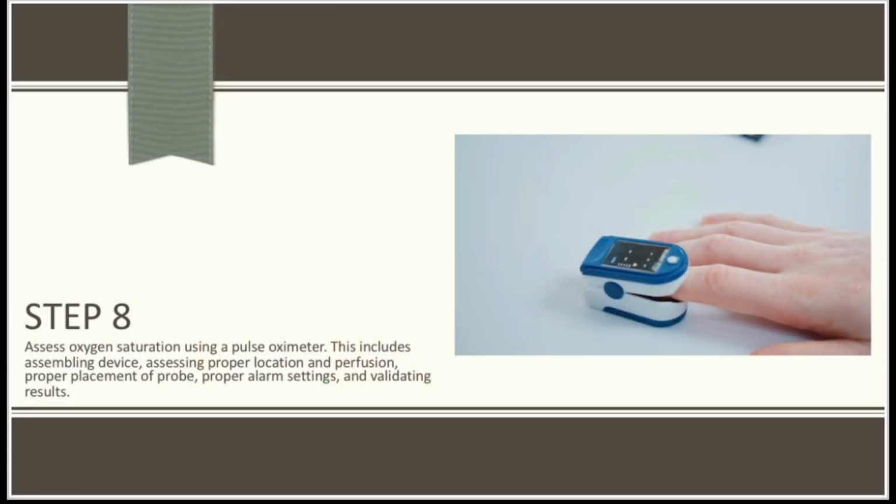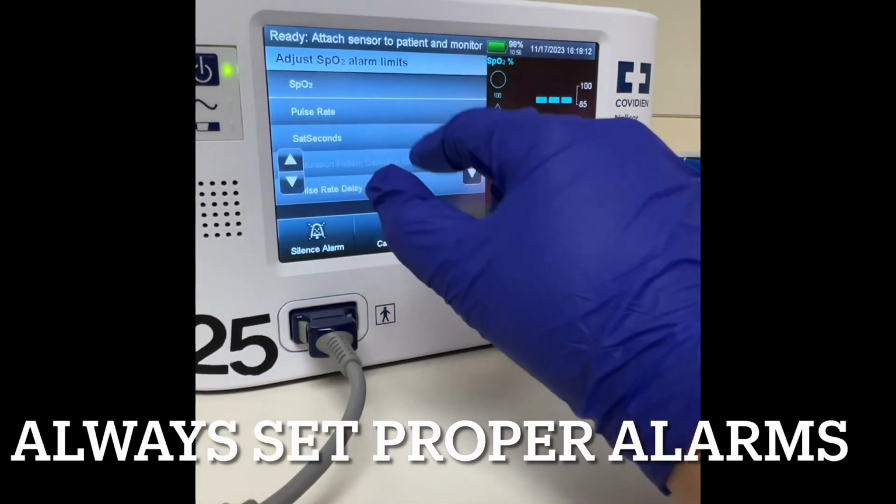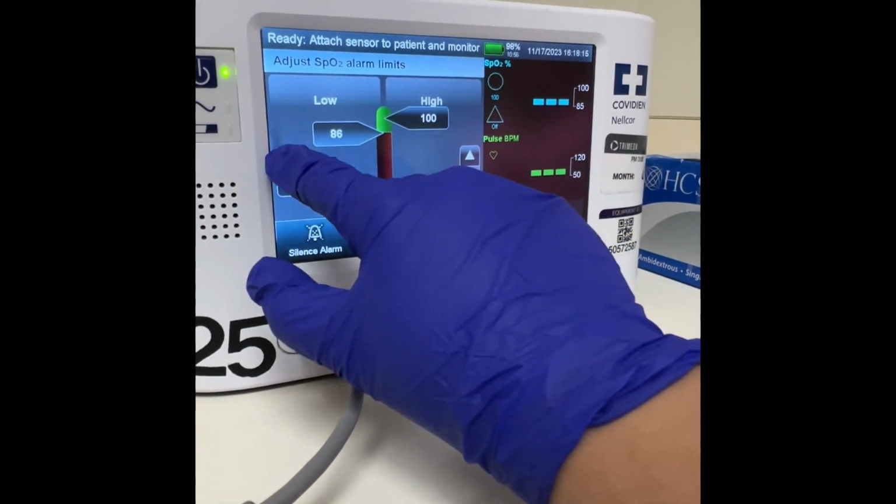We will assess oxygen saturation using a pulse oximeter. This includes assembling the device, assessing proper location and perfusion, proper placement of the probe, proper alarm settings, and validating results. By setting proper alarms, you will be alerted if the patient's vital signs differ for any reason.